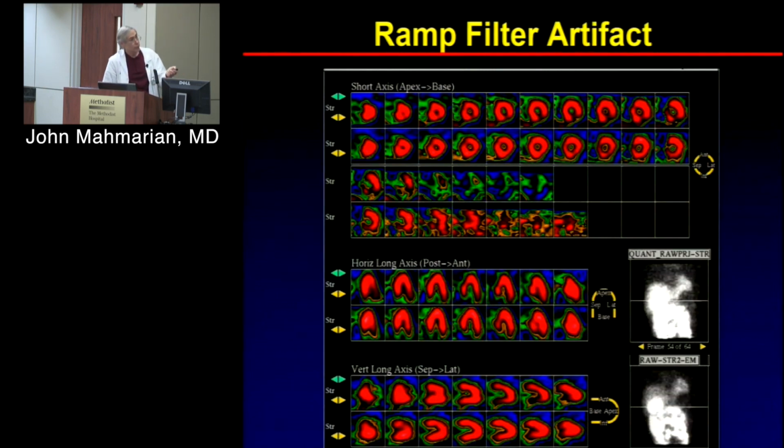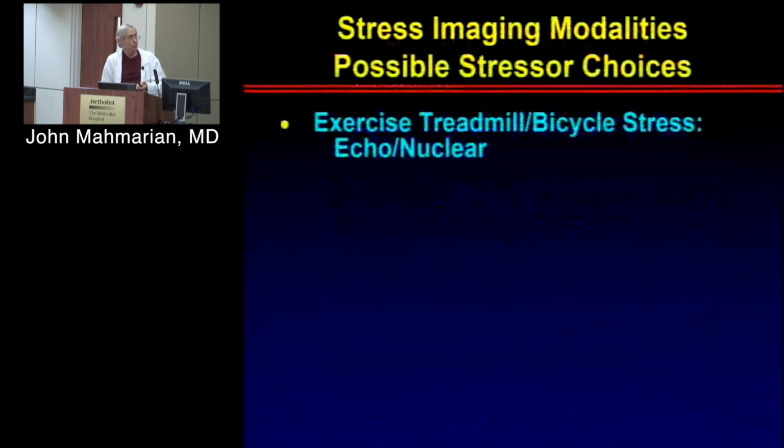But this is very contentious, and that's one of the reasons why we try adamantly to get rid of gut when we're doing imaging, because it leads the reader, myself and Dr. Nabi and Dr. Chang, in deep trouble when we see this kind of subdiaphragmatic count activity, which can alter and create perfusion abnormalities that are just artifact and not real. Okay?